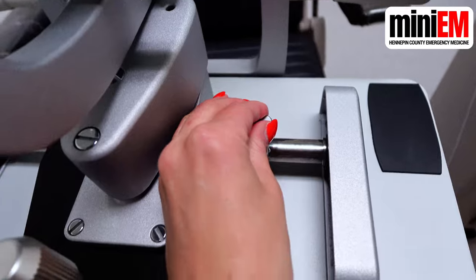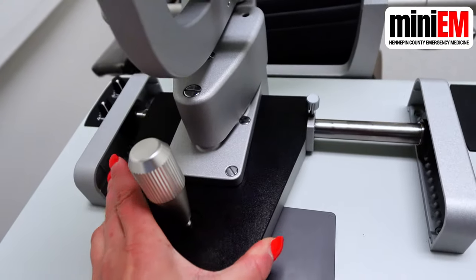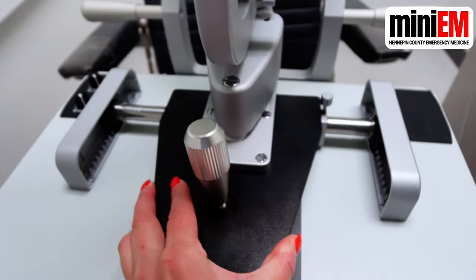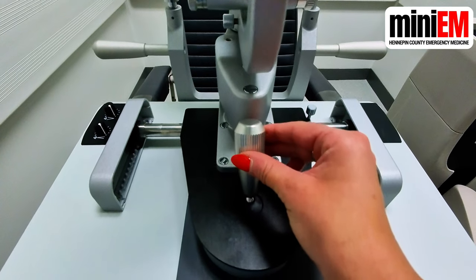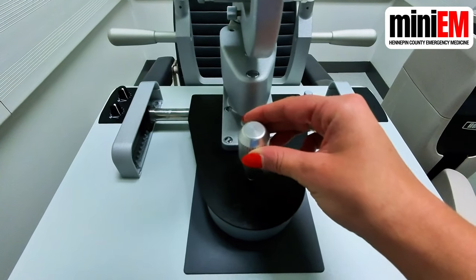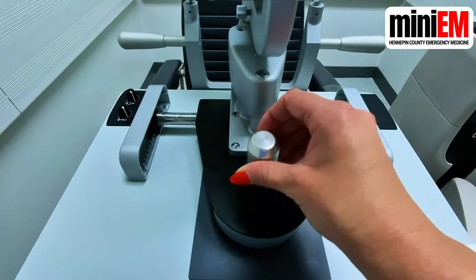Turn the screw on the base of the machine to unlock it. When you have your patient sitting there, push the base around until you get a gross view of their eye. The joystick is what you use for fine focus — push it left to go left, right to go right, away from you to go forward, and towards you to go backwards. Spin it clockwise or counterclockwise to move it up and down.